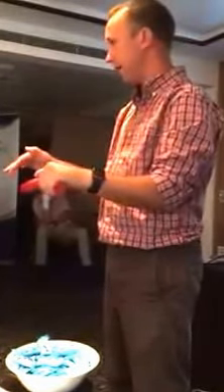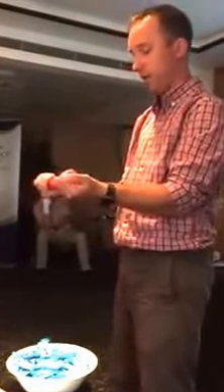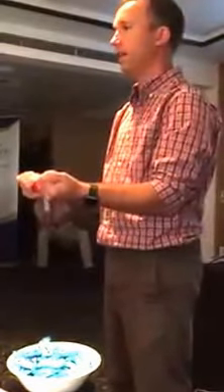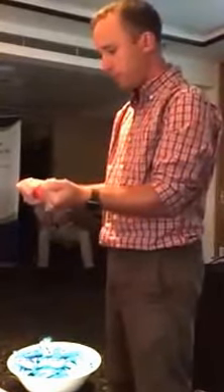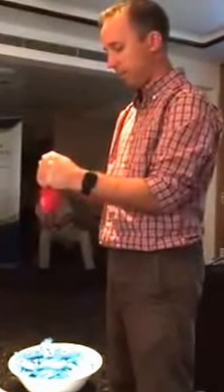That's the technique for going down — lock it in with the frown, put it down. Going up, it doesn't matter whether the thumbs are on the outside or on top, but when it's going up make it smile — make the bar smile. Same concept: bring it straight up, touch, straight up, touch. Up is radial stabilization and down is ulnar stabilization.